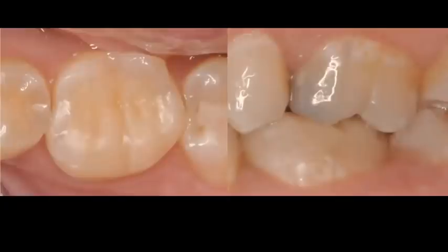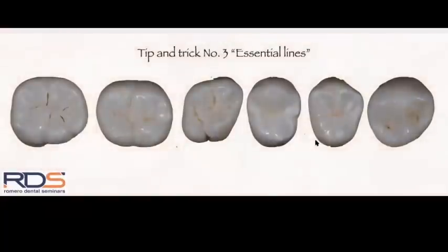And this is after, I think, 15 or 30 days later. You see it highly polished. I was just checking on the patient, making sure that there was no hypersensitivity, and the patient had no sensitivity. This is the occlusal view of the completed restoration, and this is the buccal view, and you can see the very nice transition between the composite and the actual tooth structure. So very nice and uniform. And again, we all know composites are really good restorative materials, so nothing to say about that. But again, it's just about thinking about the technique.